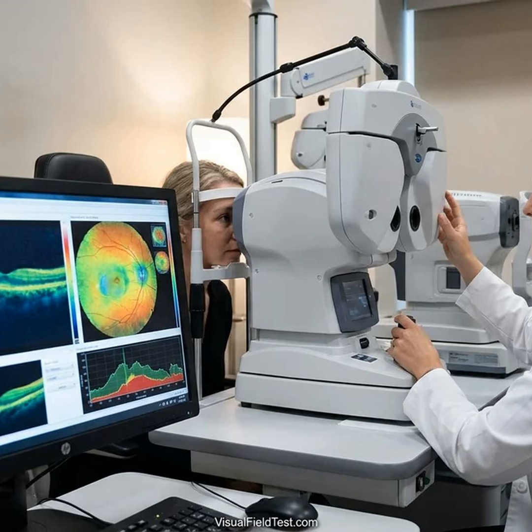If OCT is abnormal but fields are still normal, the doctor may watch more closely or do repeat fields. If fields are worse but OCT looks stable, that also triggers caution and possibly a different testing strategy, like using a smaller stimulus size or a central field test. A study even showed that combining OCT and field data finds progression faster than using the field alone.